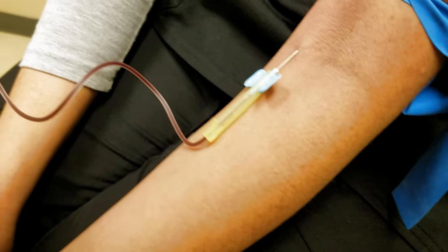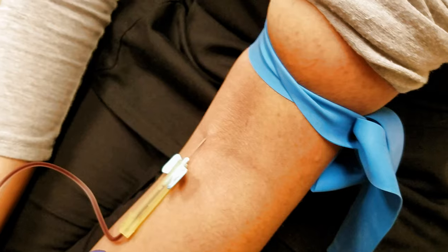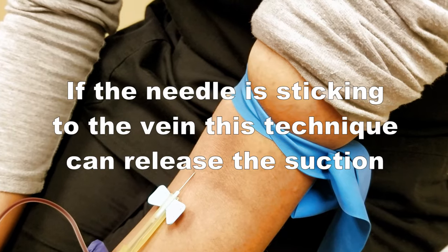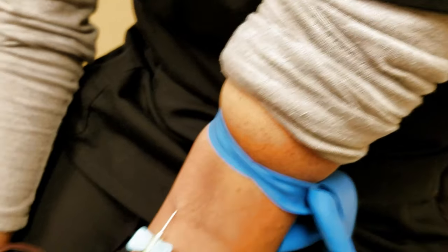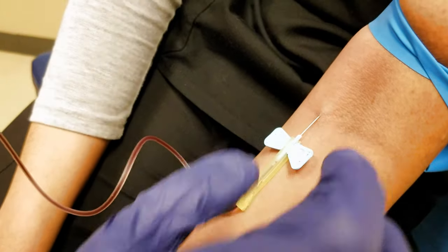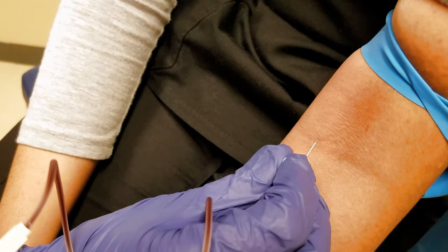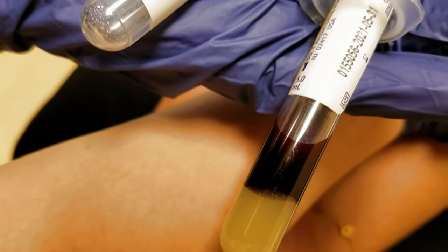The first thing I would do is take your finger and go under the yellow part — just one finger — and just barely lift up. Watch the return and see if it changes. Lift up. It's still going slow, so you're going to need to let go and grab the blue wing and push in one millimeter in the path of the vein. There we go — now it's sped up.